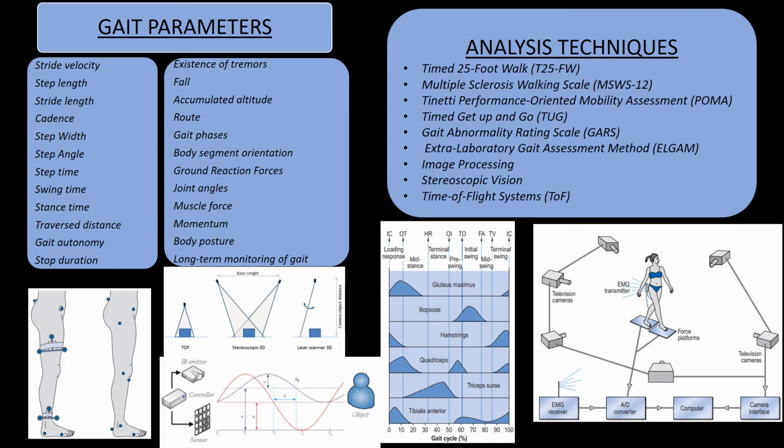Stereoscopic vision method can be used to determine the depth of the points. This technique is based on creation of a model through the calculation of similar triangles between the optical sensor, the light emitter, and the object in view. Time-of-flight systems are based on cameras using signal modulation that measures distance based on the phase shift principle. There, the phase shift, which is proportional with the covered distance, is measured in parallel within each pixel.